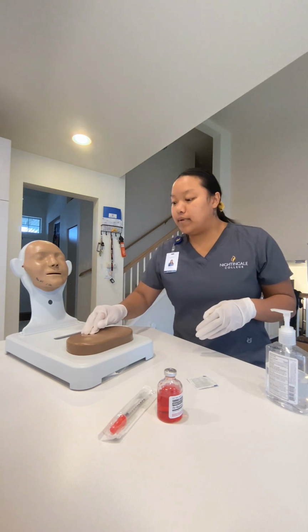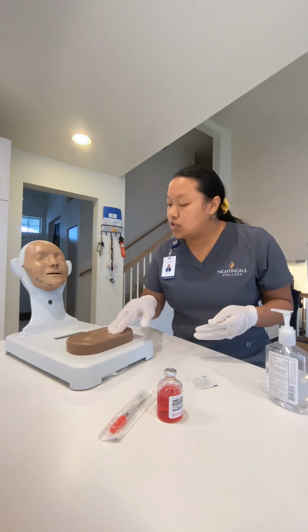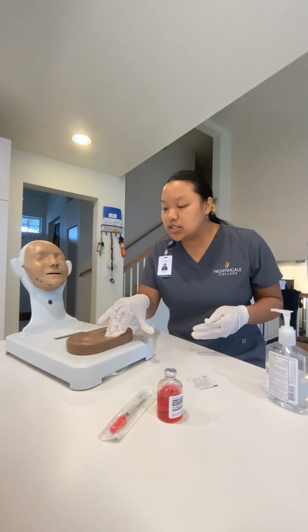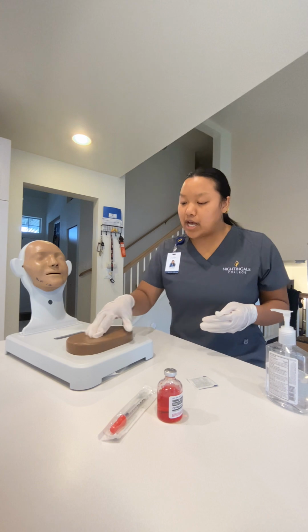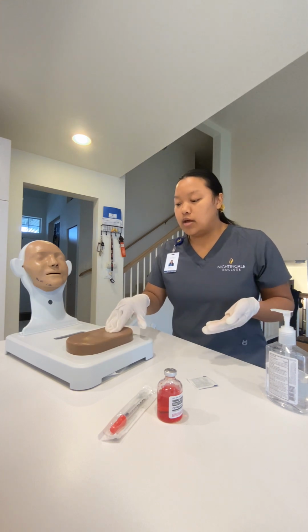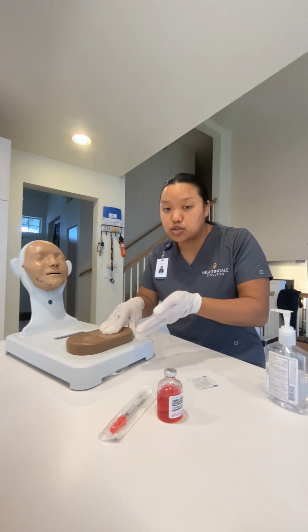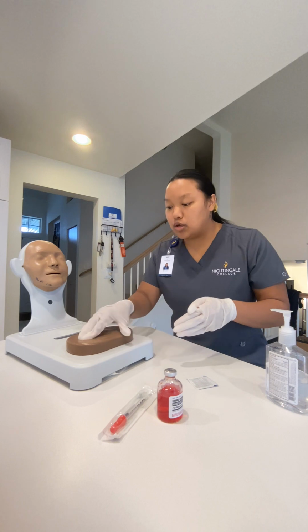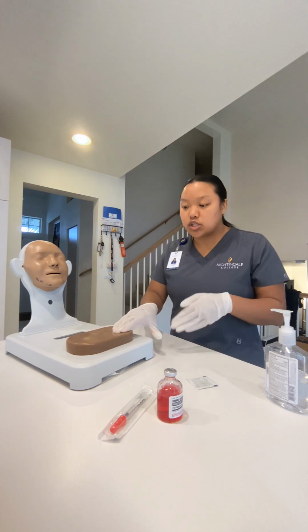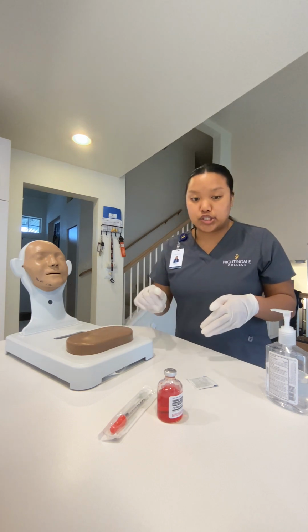I'm gonna go ahead and palpate. Do you have any pain or tenderness here? No, there's no pain or tenderness. There's no lesions. There's no bruising in this site. And I wanna make sure that if we're gonna inject this more, or if she already got poked so much over here, we wanna rotate those sites. So I'm assessing and palpating. There's no areas of concern right here. So this is an okay area for us to inject, okay?